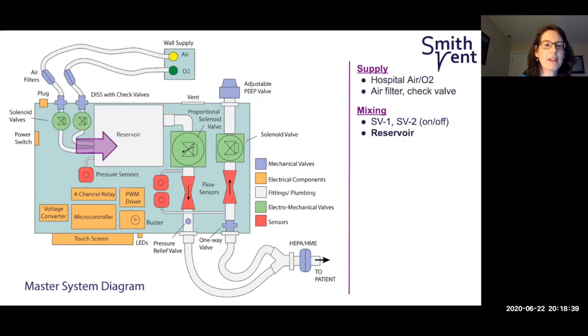The air and the oxygen are then combined in the mixing reservoir. For ease of speaking, I'm going to refer to the gas mixture as air or airflow for the rest of this section, but keep in mind that it could contain up to 100% oxygen, depending on the system settings. We continually measure the pressure in the reservoir using a pressure sensor and control the opening of the first two solenoid valves to keep the reservoir pressure between 10 and 25 psi.